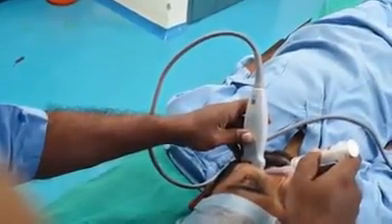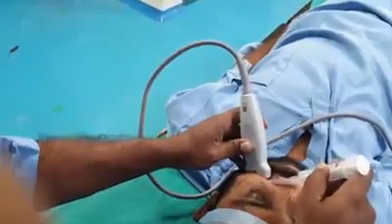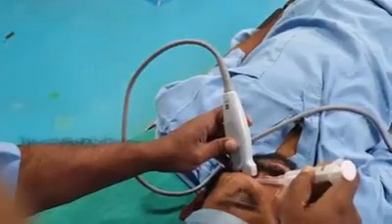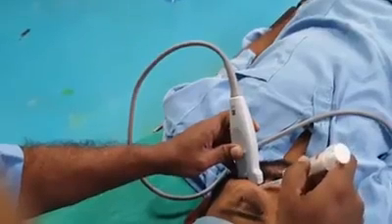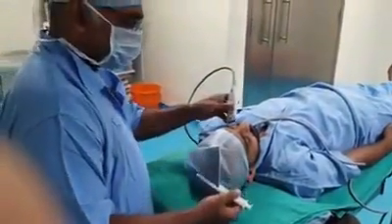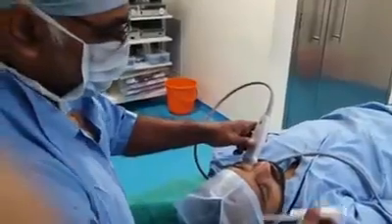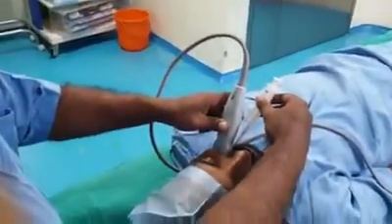So what I will be doing is a lift-off technique. You lift the medial side of the probe with a lot of gel on the medial side, and the needle is passed. Now coming to the left side, you can also go for the out of plane technique. That is, the probe is kept the same way, and the needle is going to come from the inferior side.